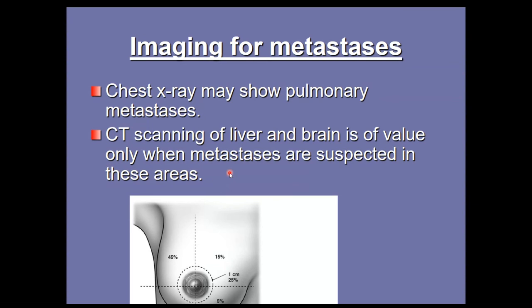For bone, we use the bone scan. A bone scan is a radionuclide scan of the bone, because I told you about the multiplicity of the lesions. We always perform a radionuclide scan.